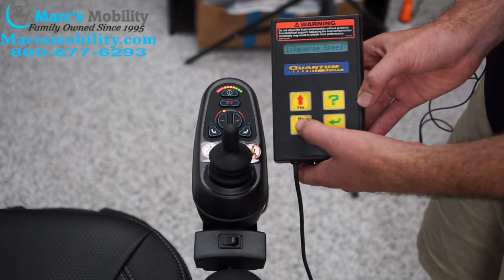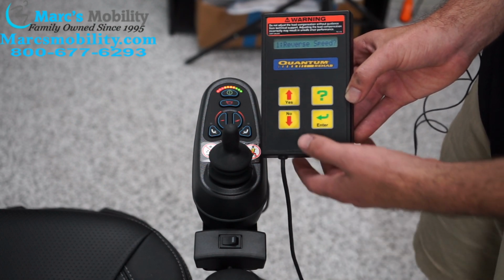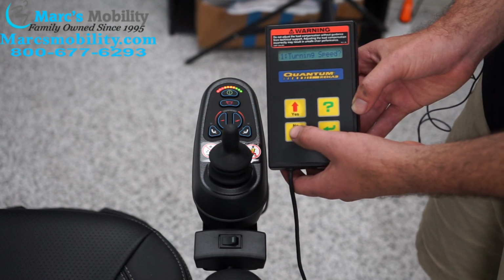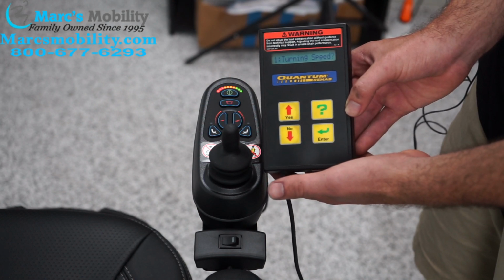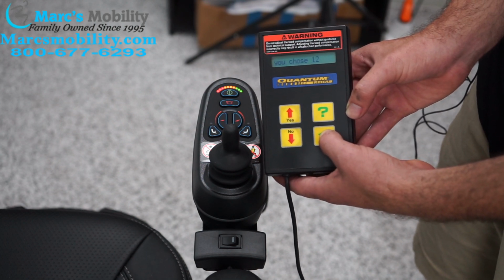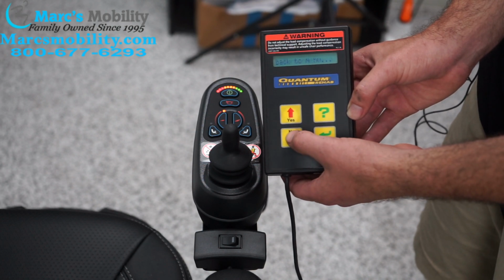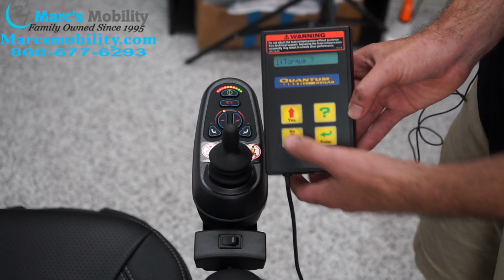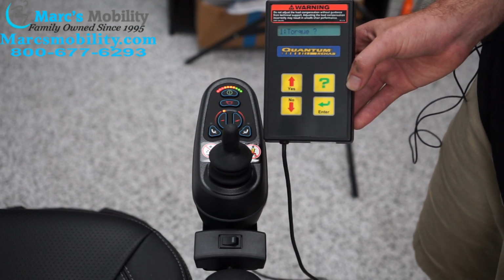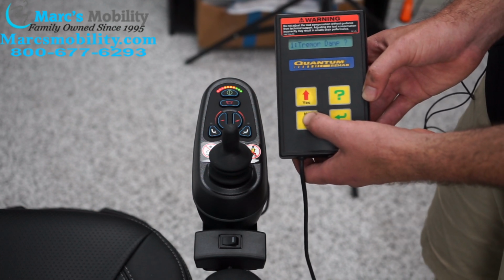Reverse speed is how fast the chair goes backwards. I would not set this any higher than 40 for safety reasons. Turning speed, I would not set this any higher than 25 for safety reasons. On the lower profile, it is currently set to 12. I have torque, which is how much power the motors have. You should not need to edit this. You should be driving on flat, level surfaces. So the way it comes from the factory should be fine.